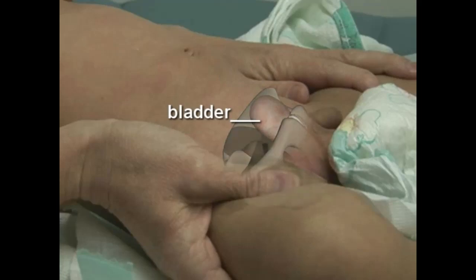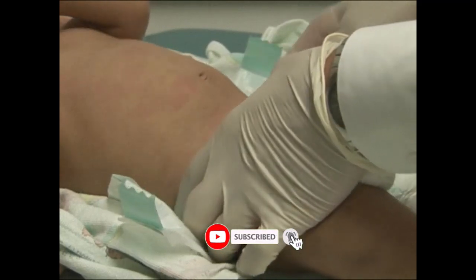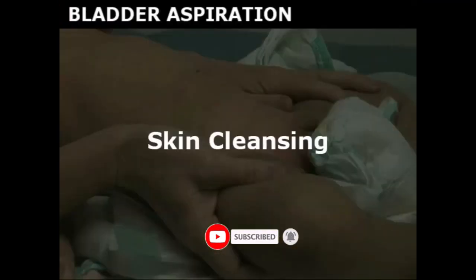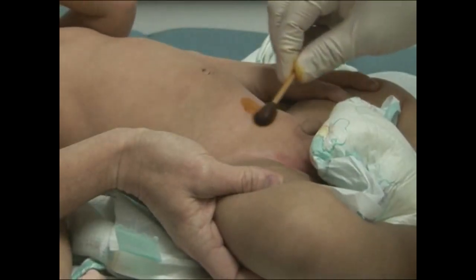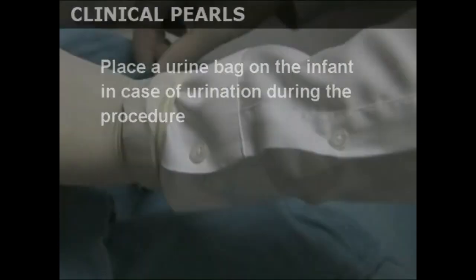Palpate the bladder, though it may not be palpable in a distressed infant. Cleanse the skin with betadine and drape the area around the pubis. Placing a urine bag on the infant is advisable in case the child urinates during the procedure.